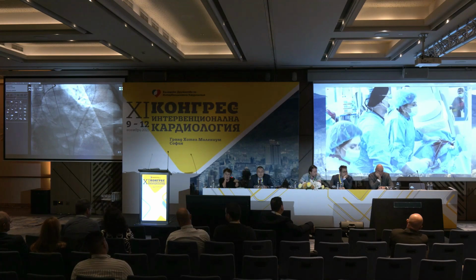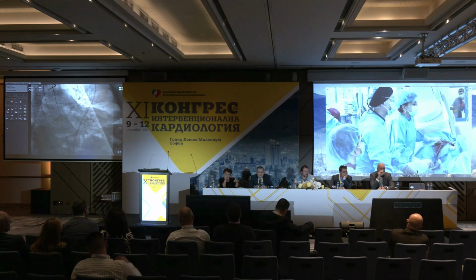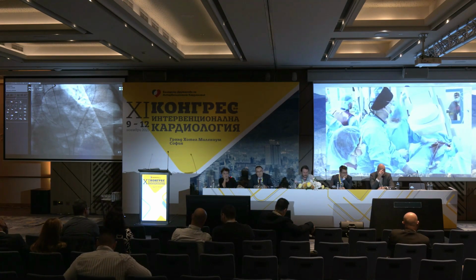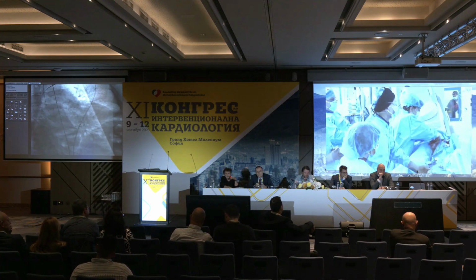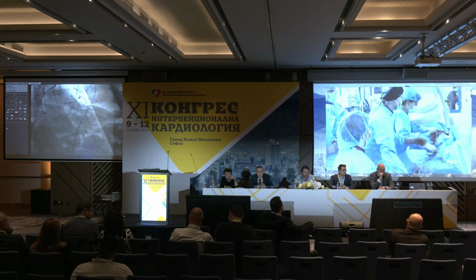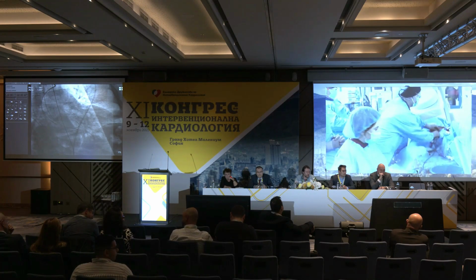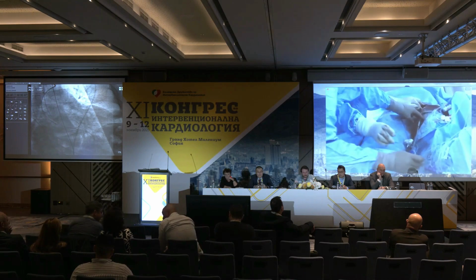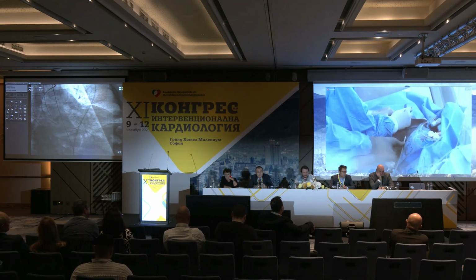And because there is a lot of data from STS with good results with the Evolut system. Yes, and here we have to say that it's an Evolut Pro. I have Pro Plus. Pro Plus is the latest generation of the Evolut system with the additional skirt, which prevents aortic regurgitation in these patients.